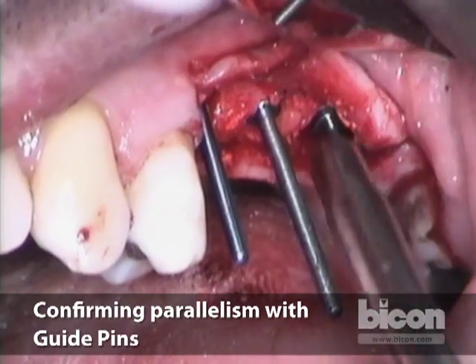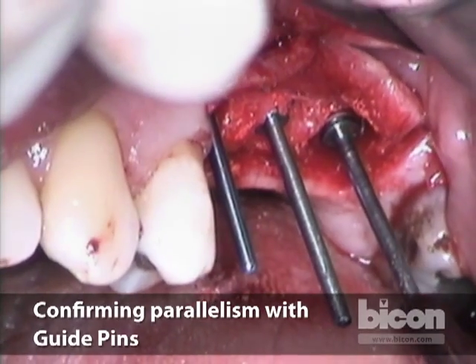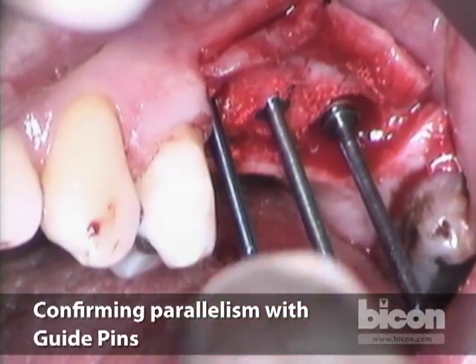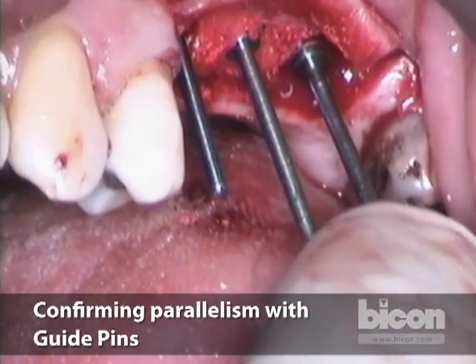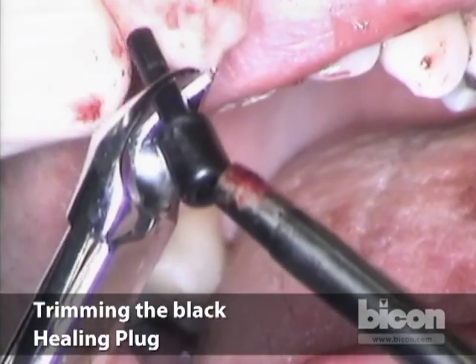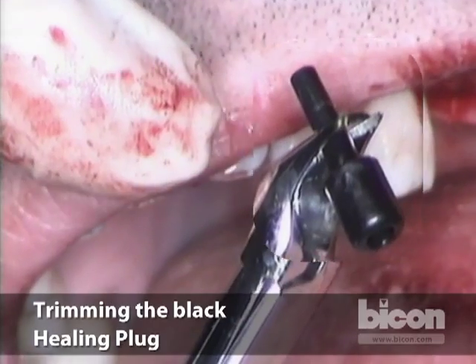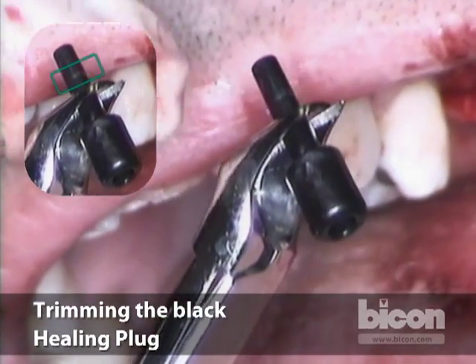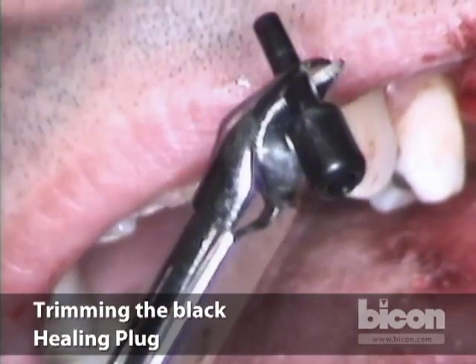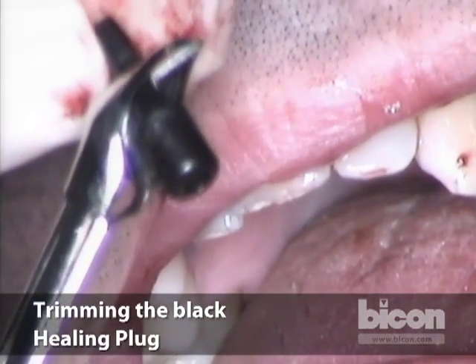We change the angulation ever so slightly — that's easy in soft bone, and in this case it's the softest of bone. I will estimate the depth at about two millimeters from the top of the implant. There's a little bit of a mark made by the implant having been packaged with this healing plug — it makes a little mark, enough for me to know how high the implant is, and I cut about two millimeters above that.